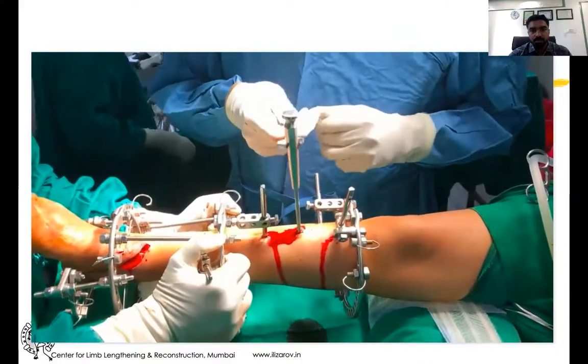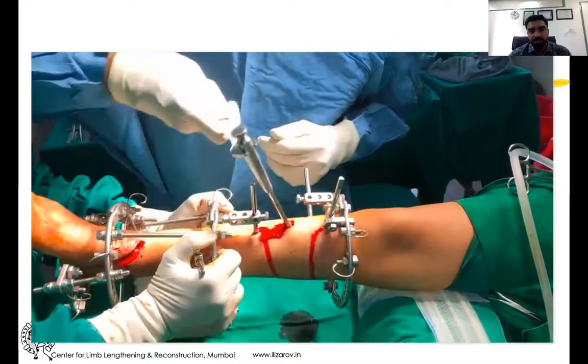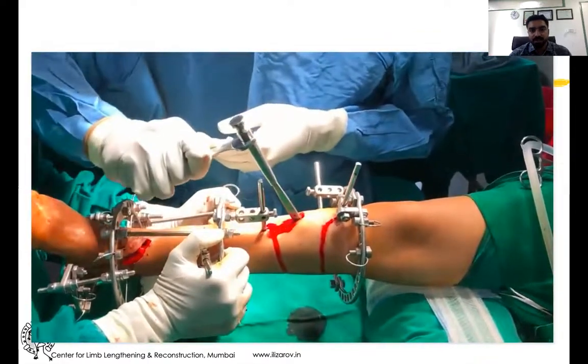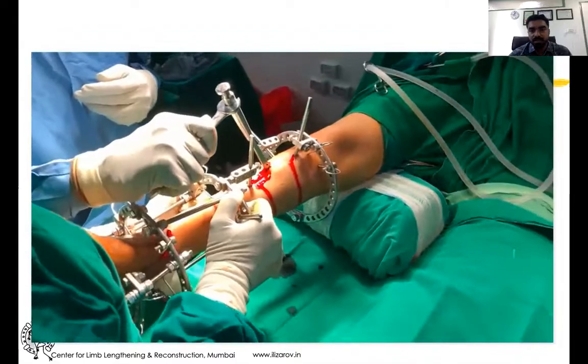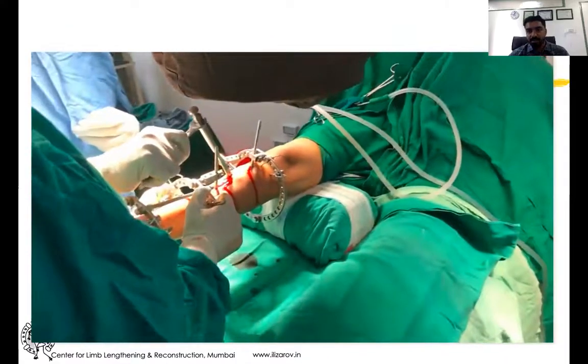This osteotome has a wrench placement or overhead handle, which is useful. You can get a translation between the fragments at the osteotomy site with the use of a wrench. You can also appreciate it under the C-arm, and clinically you can also judge as the segments are moving apart.